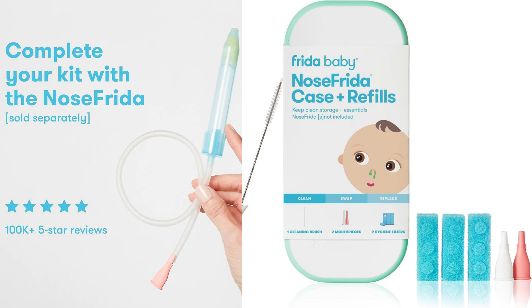Overall, I am quite pleased with the Frida Baby Nose Frida Case Plus Refills. It provides a practical and hygienic solution for storing and cleaning the Nose Frida nasal aspirator. The case is well-designed, durable, and travel-friendly, while the included hygiene filters and cleaning brush add value to the package. If you already own a Nose Frida or plan to purchase one, I would highly recommend investing in the Frida Baby Nose Frida Case Plus Refills for added convenience and peace of mind.